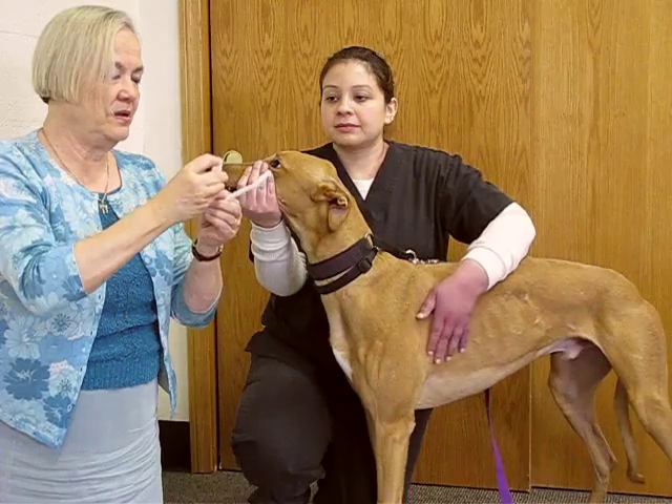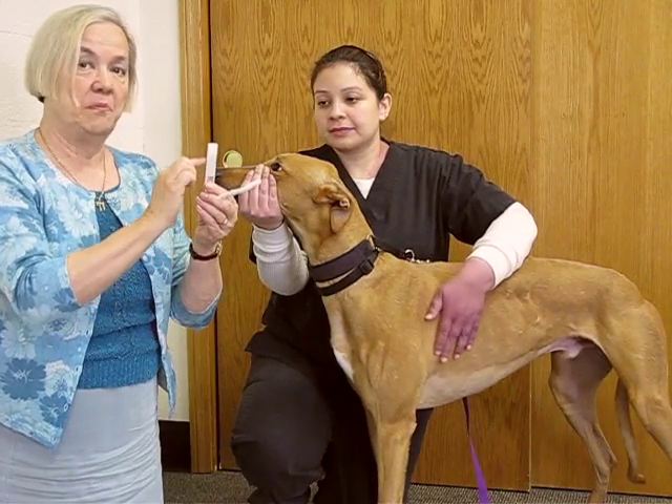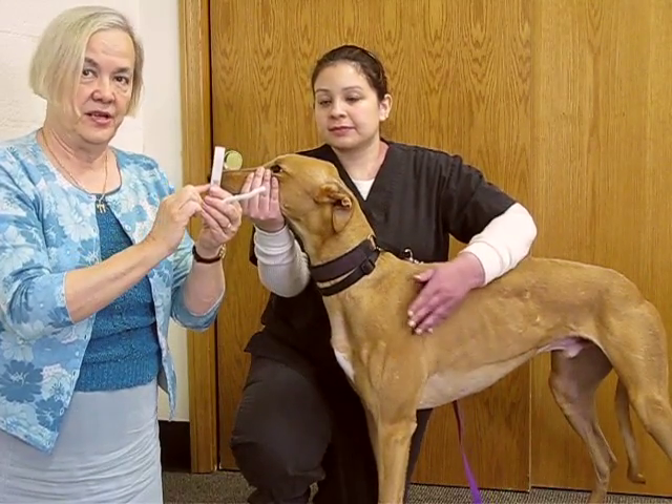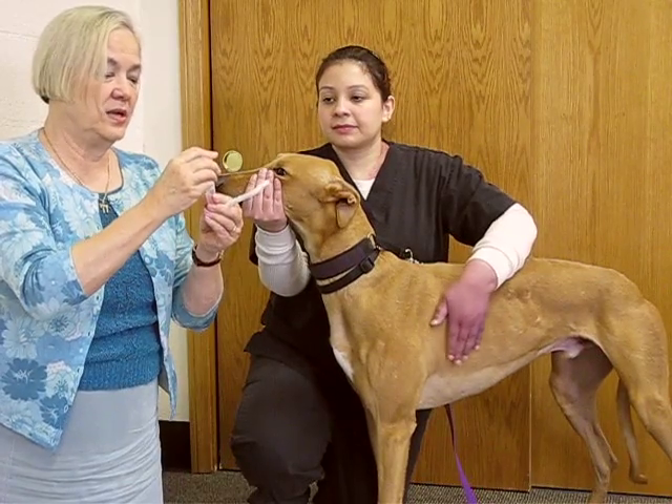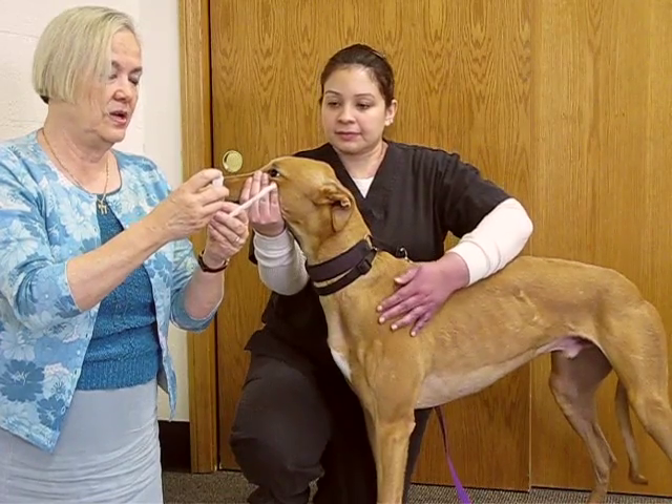And then we put the cap on, we tape it, and there's a special label that goes on the side of the tube with the pet's name and the pet owner's name. And then it's sent to us — it has to arrive within 30 days to the laboratory for testing.